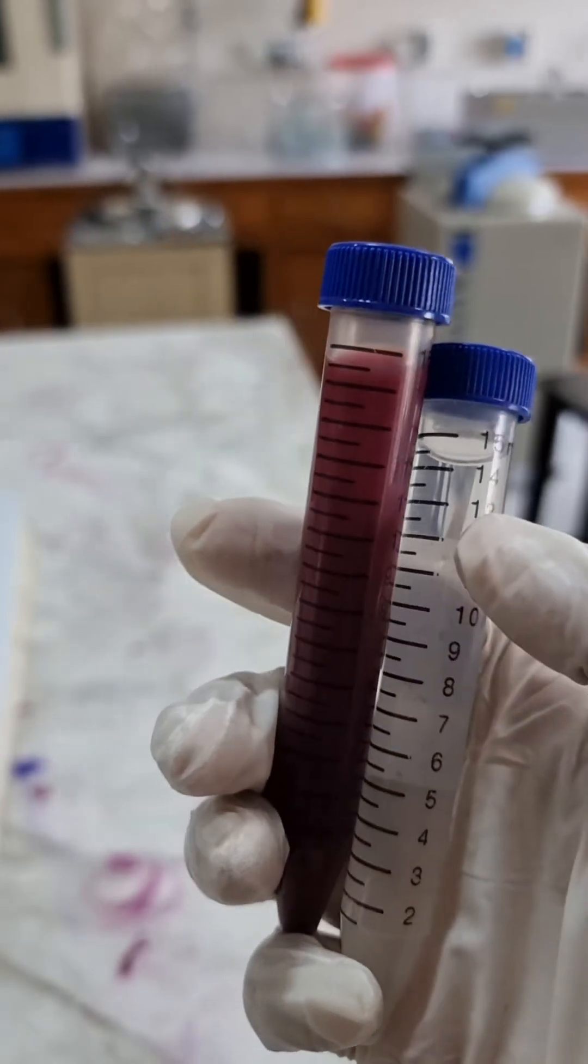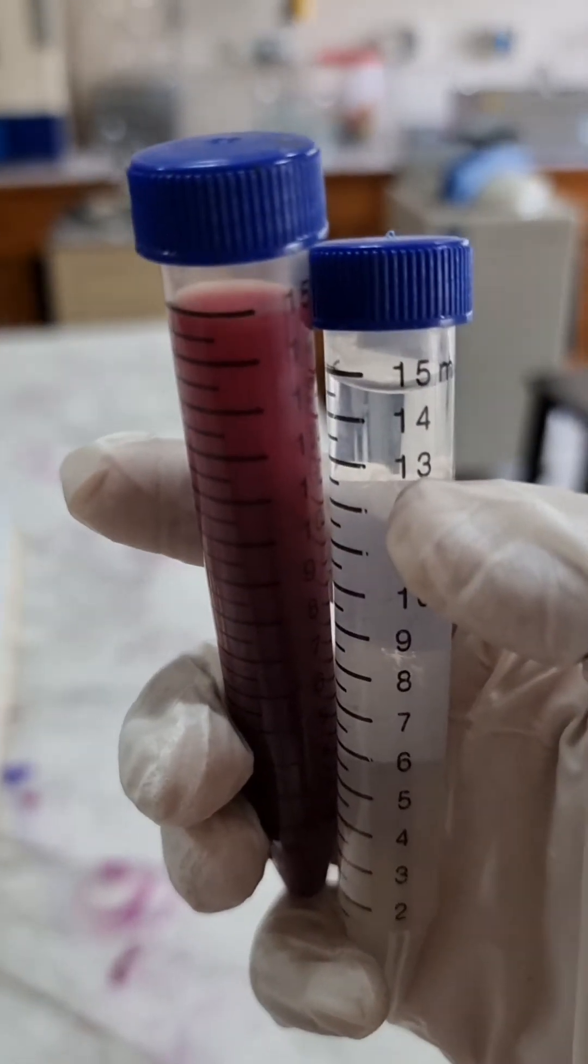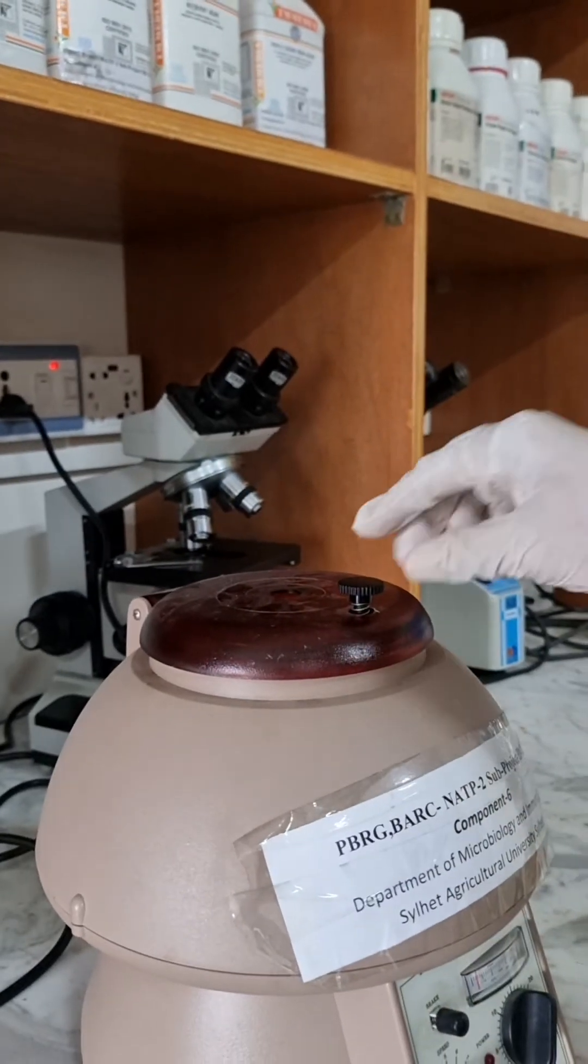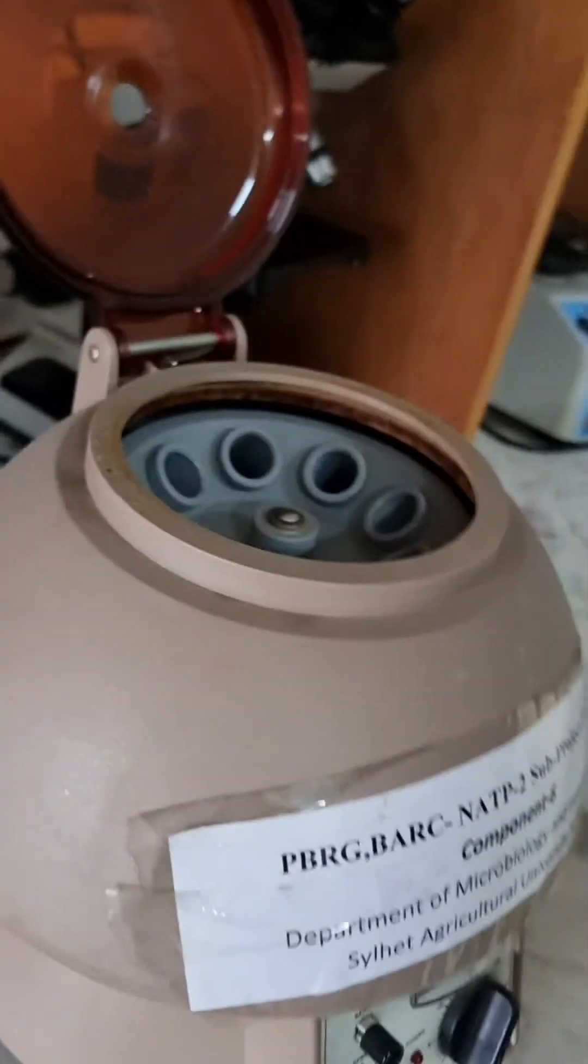Here we have added PBS to the collected blood and have taken the same amount of distilled water in another falcon tube to maintain balance during centrifugation.